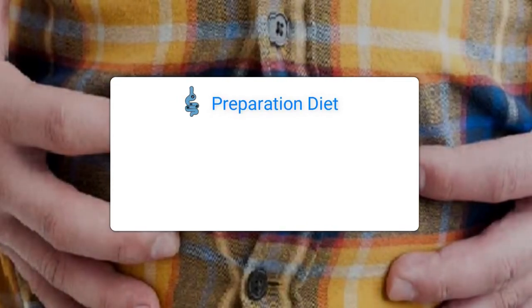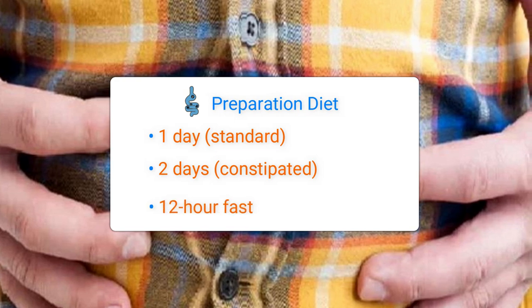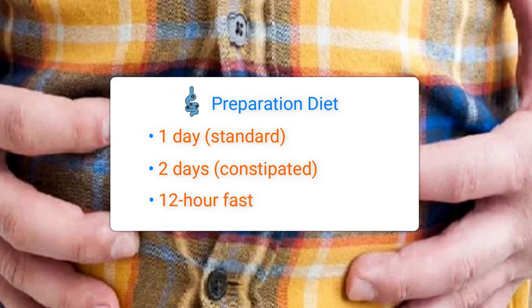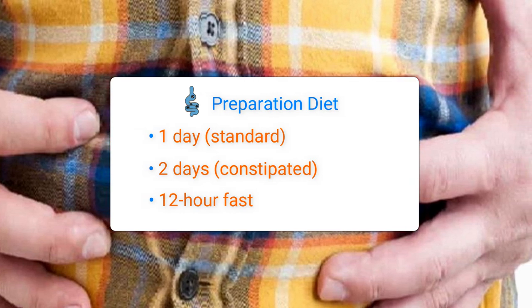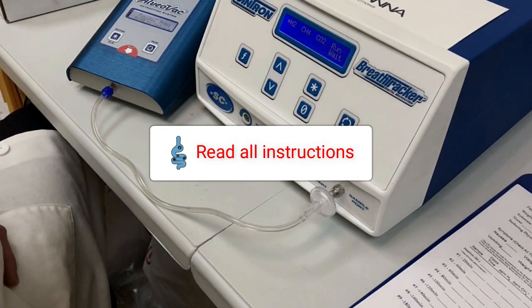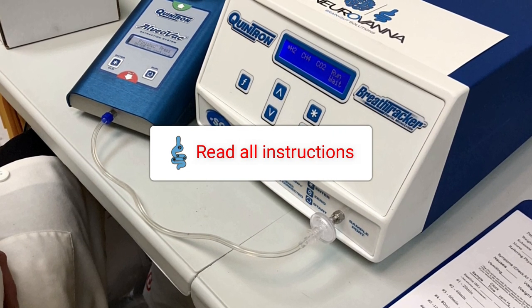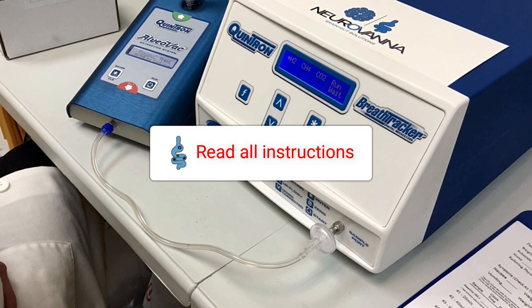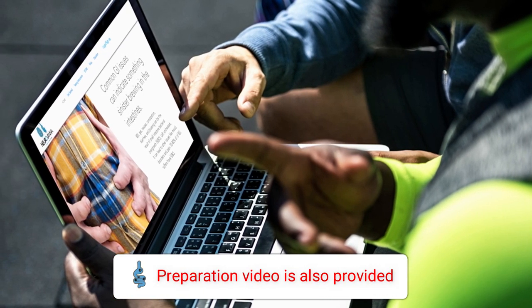Breath testing should always be done after your 1-2 day preparation diet and 12-hour fast. Please read through your Neurovana paperwork or special instructions from your healthcare provider at least once before the day of testing. Additional restrictions may apply to you, so please read through all of the instructions provided by Neurovana and your healthcare provider before testing. Neurovana also provides a preparation video for your convenience.